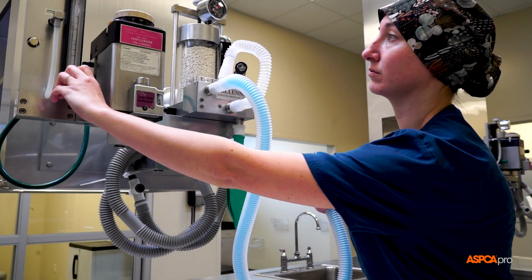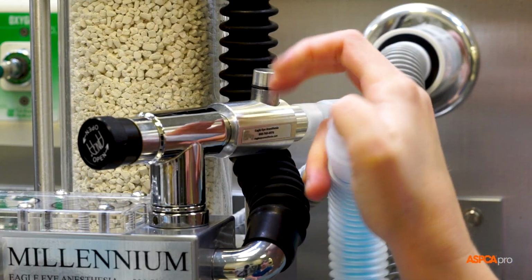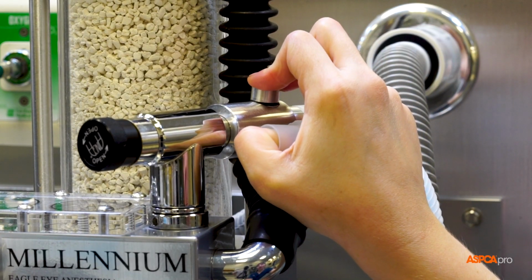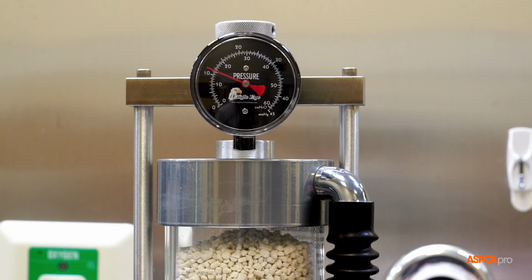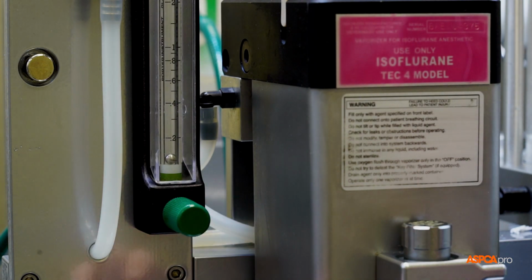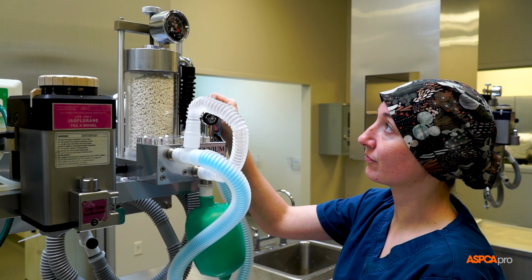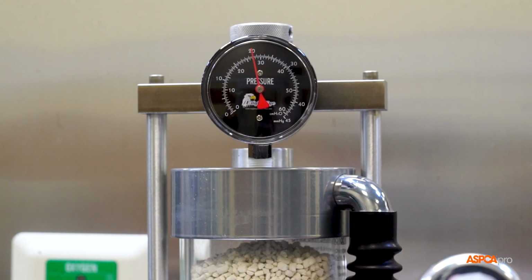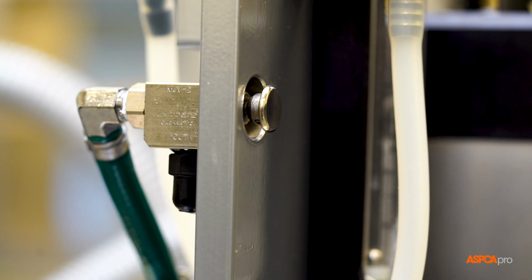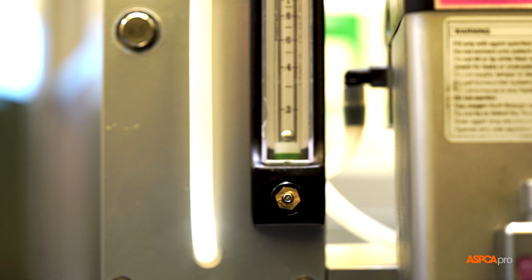Next, turn on the flow meter, which will pressurize the breathing circuit and then close the occlusion or APL valve. When the manometer reaches 20 centimeters H2O, turn off the oxygen and look for an increase or decrease in pressure. A normal system should maintain pressure for 10 seconds. If the pressure continues to rise, the flush valve may be faulty or the flow meter needle valve may need to be repaired or replaced.